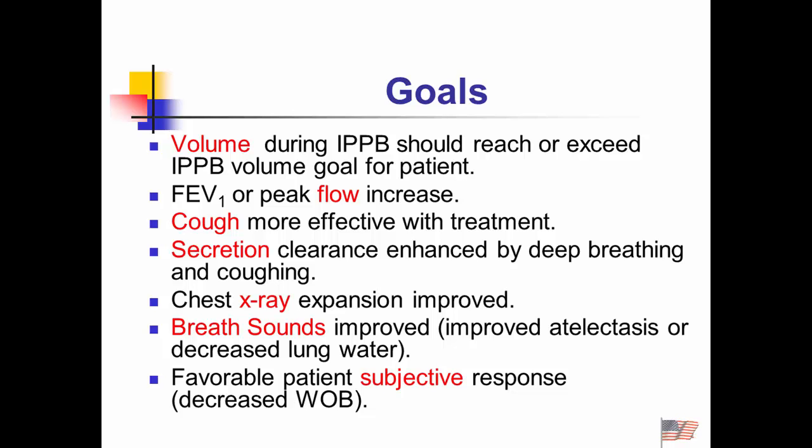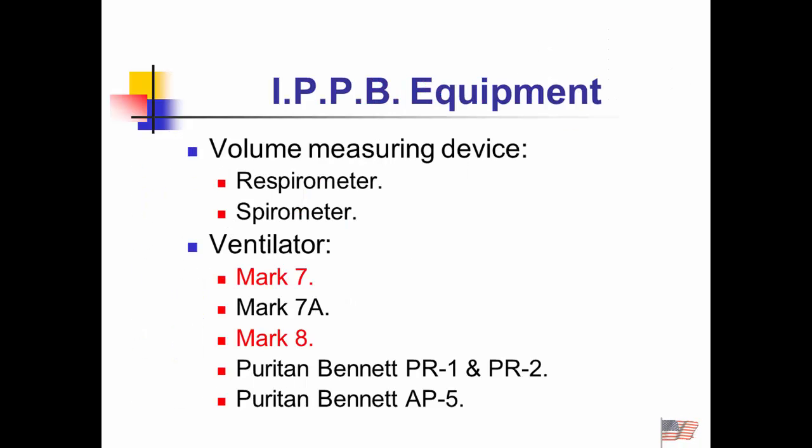We talked about breath sounds, and they should have a decrease in their work of breathing and a level of comfort for them. The primary devices that we're going to talk about using for this are focused on delivering a specific volume, so we want to have some volume measuring device. You've already seen the Wright respirometer.